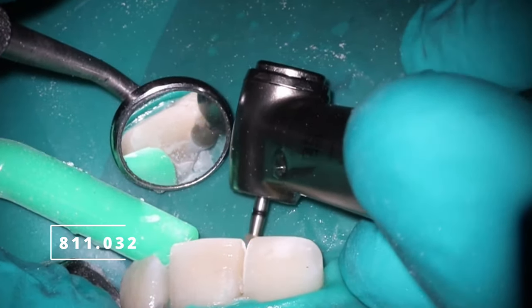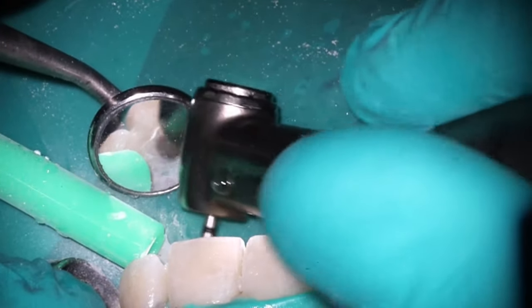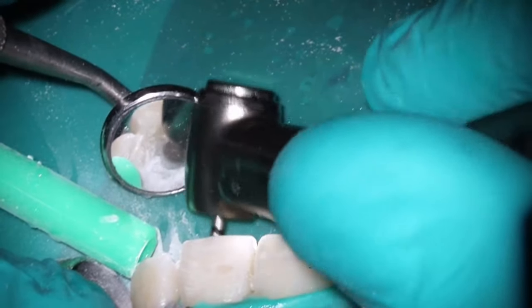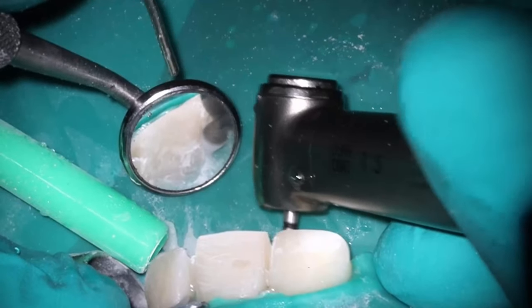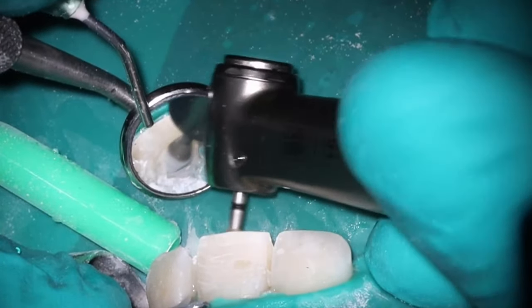Going to use that barrel burr now to do the lingual contour. I try to do as much as possible with rubber dam on. It's just a lot easier. You don't have to deal with the tongue, the lips, anything like that. And I'm looking at number 8 for the idea of where I want all of the extensions to be as far as the line angles and the cingulum and everything like that. So that's what we're doing in this process.